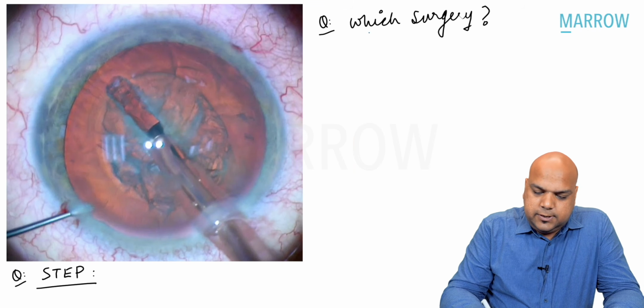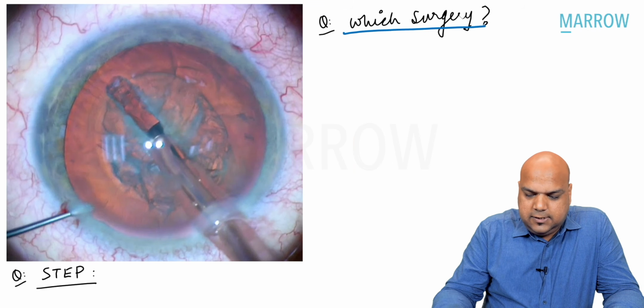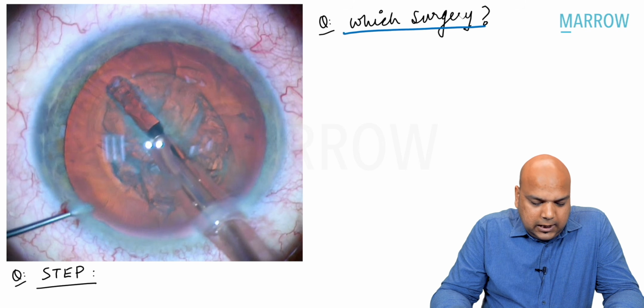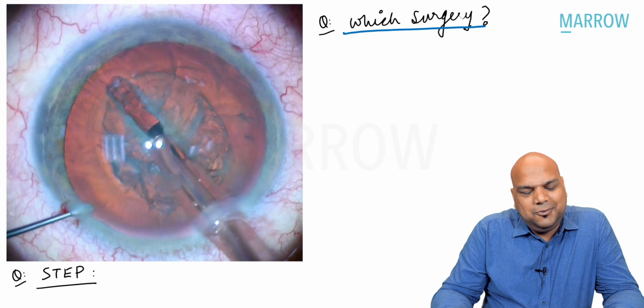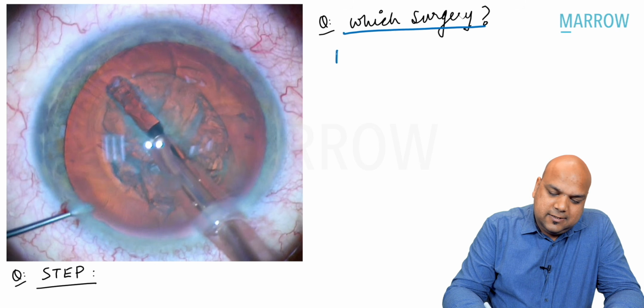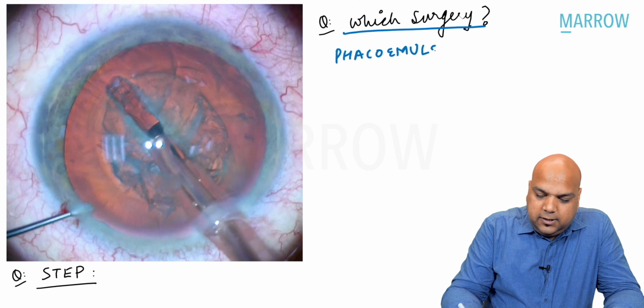Okay, so this question is asking us which surgery is this and which step of the surgery. So which surgery? Anyone can make out which surgery. Are we operating in the cornea? No, we are not. Obviously, sir, we are operating in the lens. Obviously, sir, this is cataract surgery. This is phacoemulsification. I don't think anybody should have a doubt.